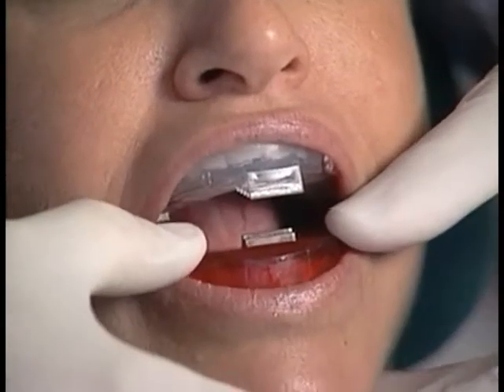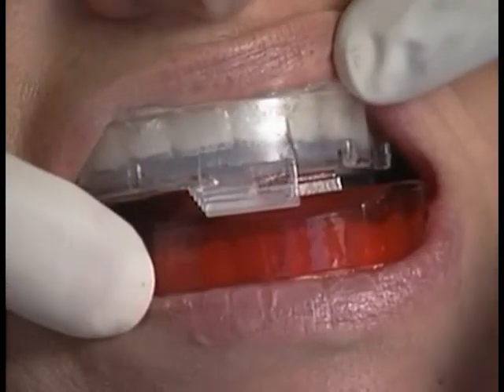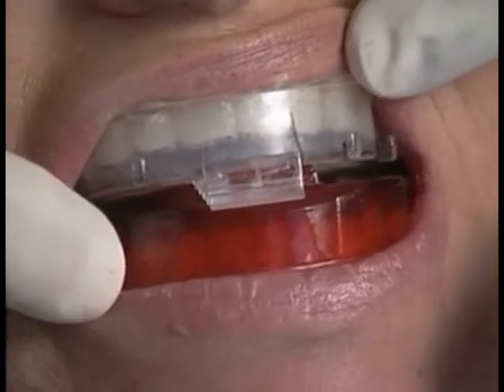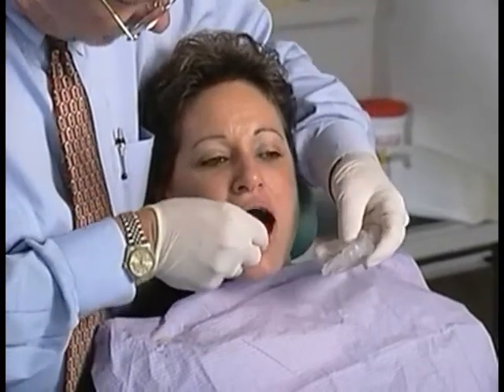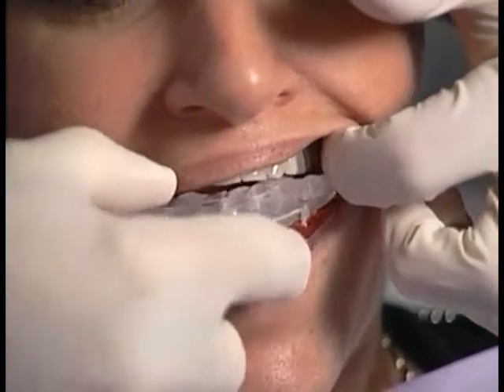Have the patient purse their lips around the entire appliance. Leave both devices in place for about a minute, and then have the patient slide their jaw from side to side while engaging the guides at the front of the appliance. If the teeth do not slide easily, place a small amount of Vaseline on the guides to allow for easier movement. Remove both the upper and lower devices and attach elastics in a triangular design. Reinsert the connected components and have the patient bite down and suck into the device for extra retention.